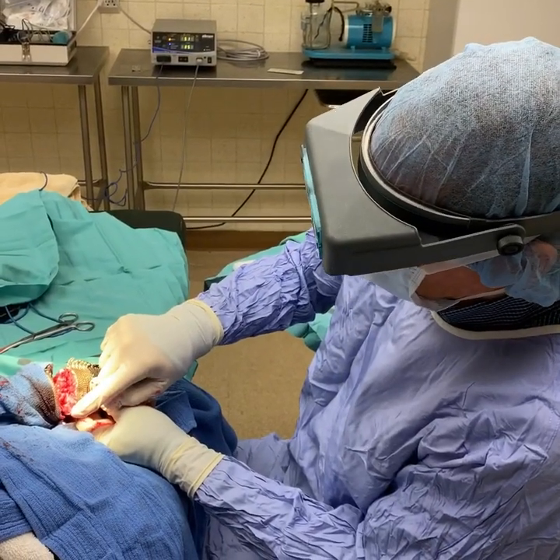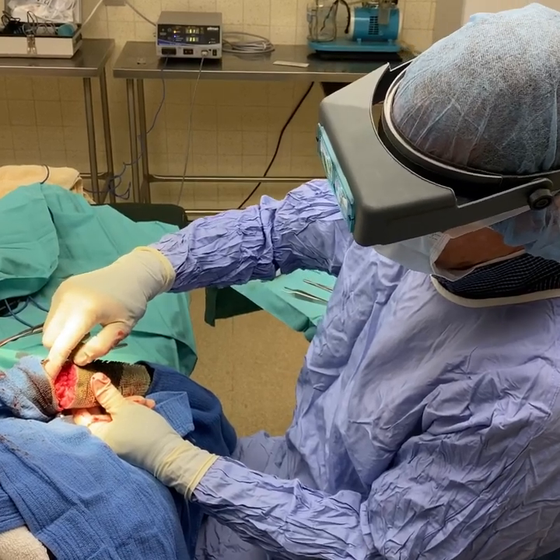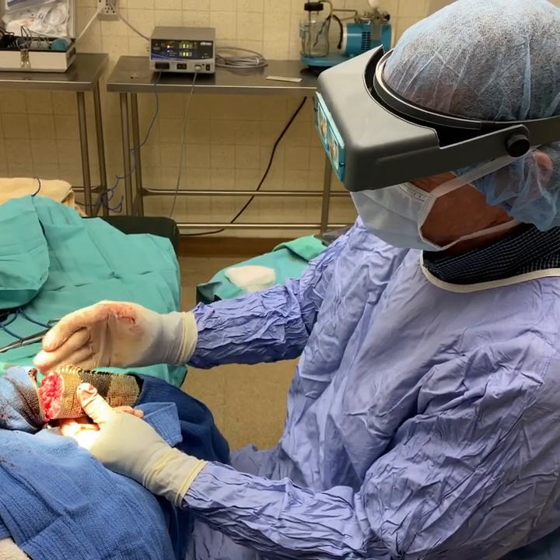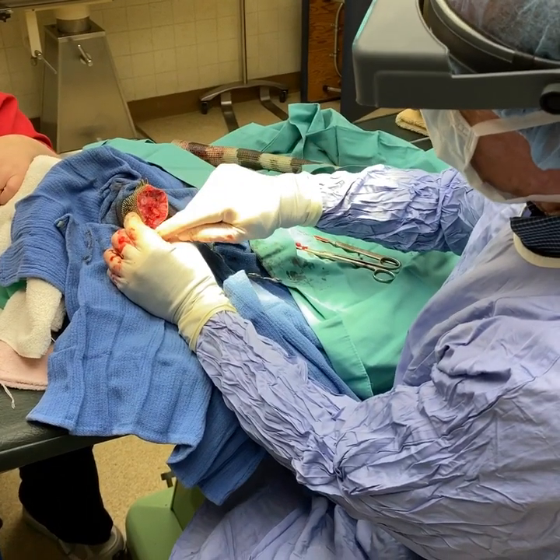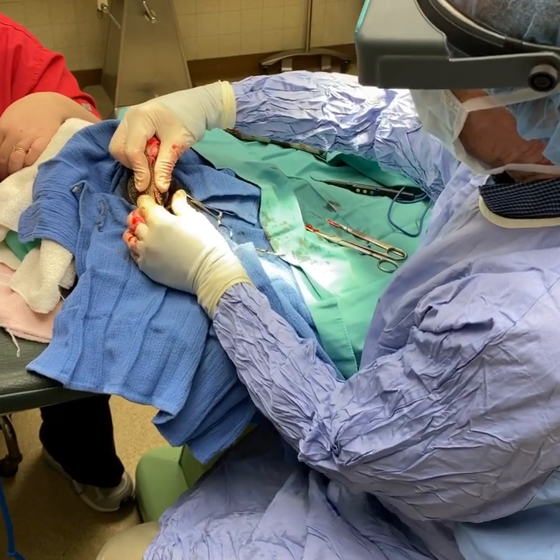We've completed the gross dissection of the tail and have dissected between the vertebrae as opposed to cutting through it. We're about to remove the tail section and then I'm going to cut a V-section of muscle tissue out of there to allow closure of the tail. We've tunneled out and cut sections of the muscle so that we can then oppose the edges of the tail.